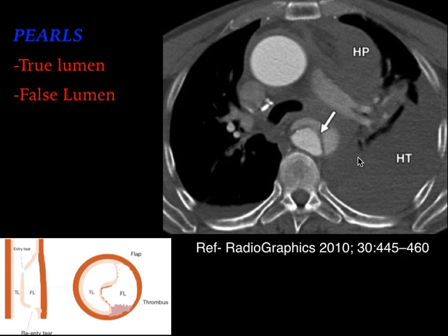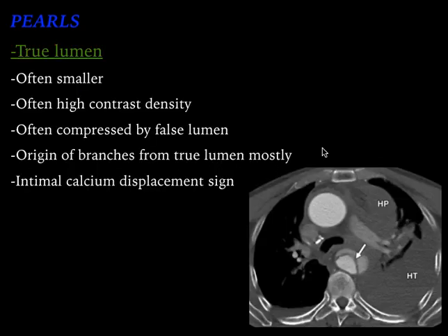Coming to the most important part of the video: differentiating the true from the false lumen. This is an axial CECT section. You can see there is a flap — the intimal flap — which is displaced. So which one is the true lumen and which one is the false lumen? Let us see how to differentiate them.